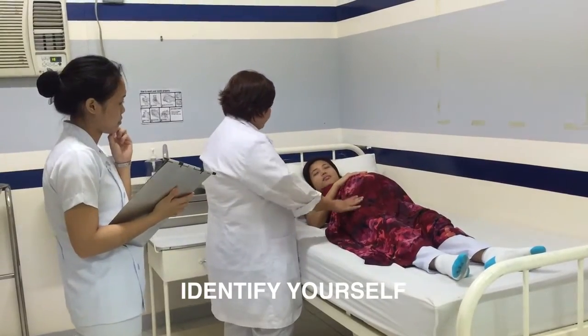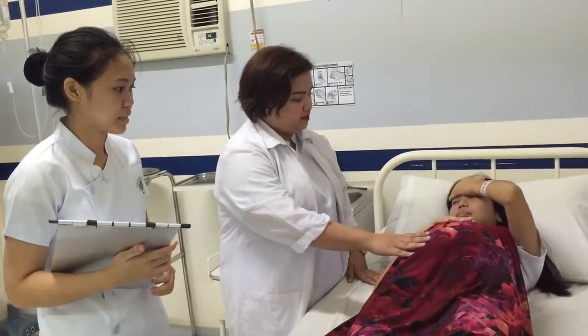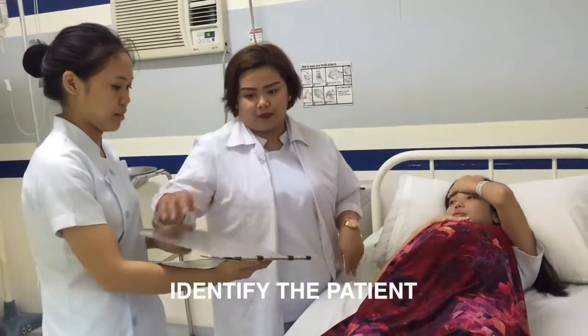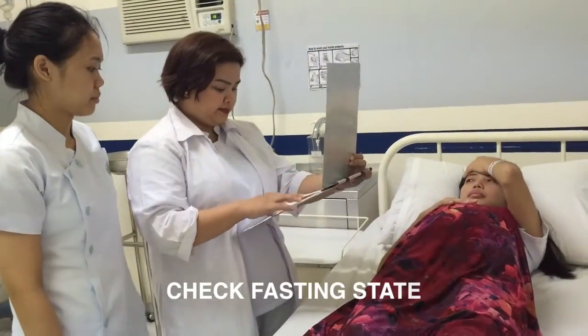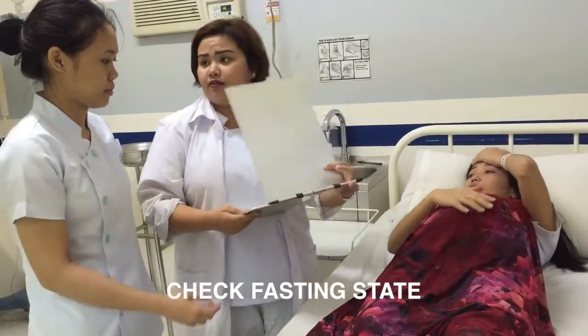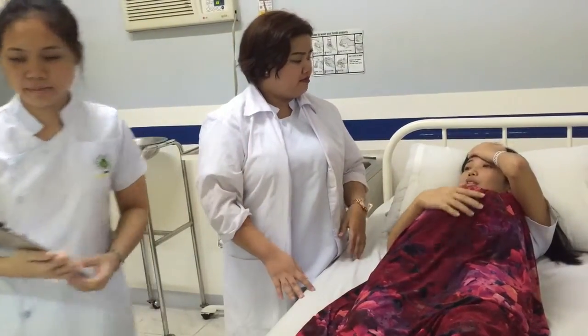Identify yourself and introduce yourself to the patient as the medical technologist assigned. Identify the patient and check the name of the patient. Check the fasting state of the patient, as some tests require the patient to undergo fasting or not eating for a certain time.